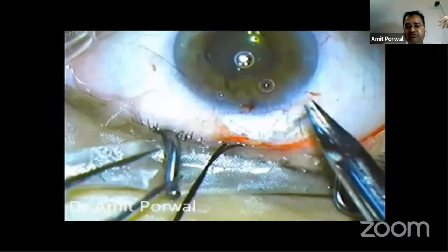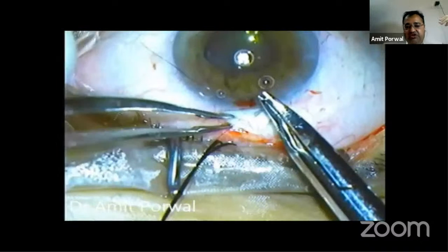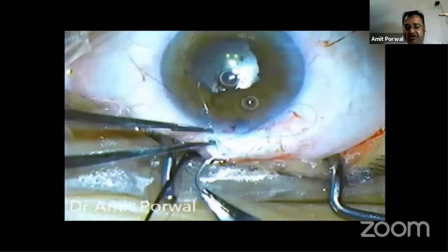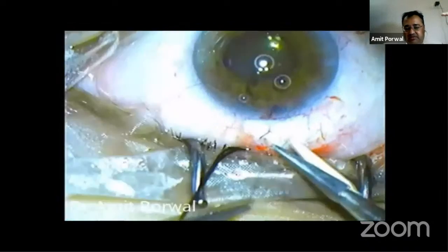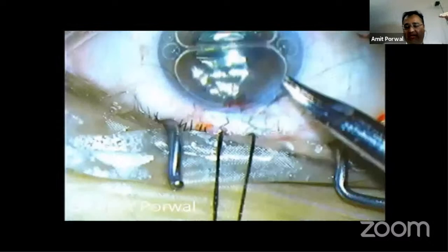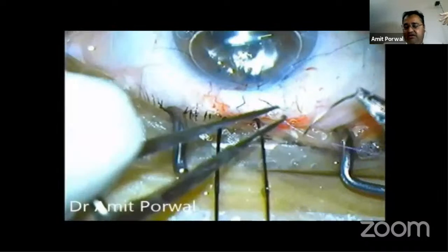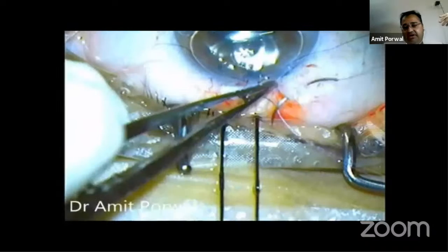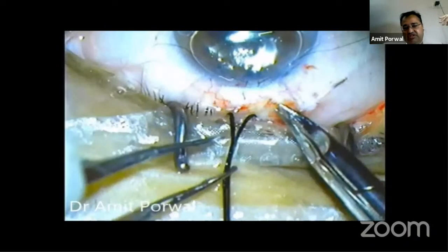The technique of the releasable suture again is very easy. You pass the suture parallel to the limbus in clear cornea. Then from the clear cornea into the scleral bed, perpendicular to the limbus, the next bite is passed, and then from the scleral flap into the interstitium. You take 4 throws, the shoelace pattern throws, and tighten. Coming to the conjunctival closure, it is very important that you do a proper conjunctival closure technique.